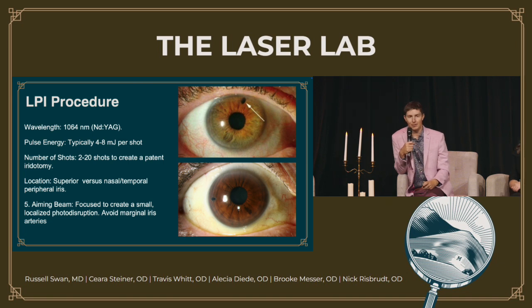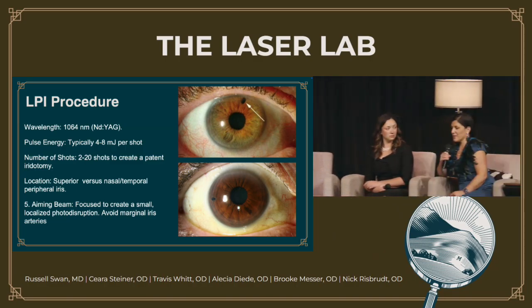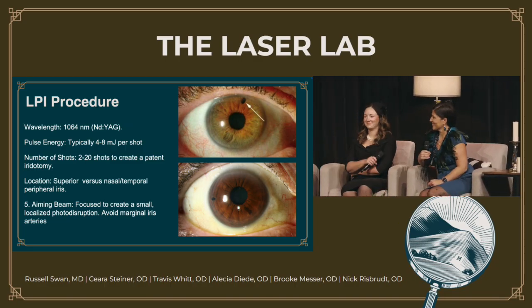Show of hands from the panelists. If you were having an LPI, would you want it superior, nasal, temporal, or inferior? We'll just go across, and you get to say which one you would have. Go. To me, it makes sense to do it superior, but I know data says otherwise. So where would you have it if it was your eye?